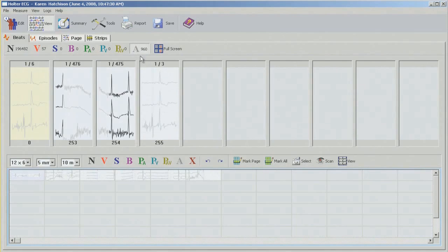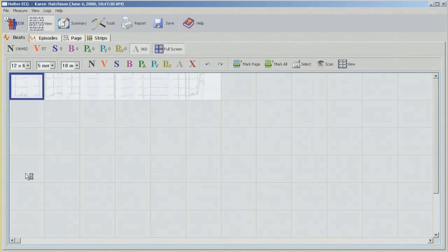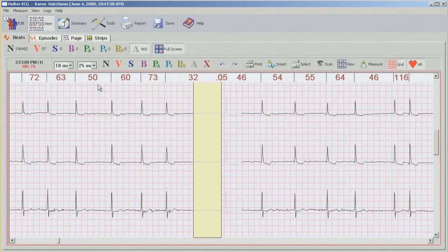And going into artifact bins, this is quite important to check, especially with AFib, because sometimes if you have a slow AFib, you may have some pauses as you can see right now. So these three boxes do contain some pauses. So I'm just going to go into each single one of them, one at a time.